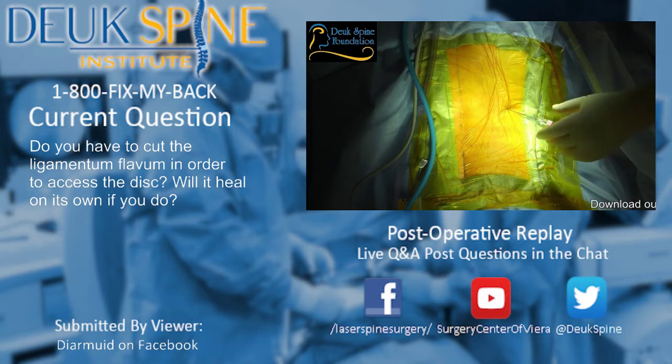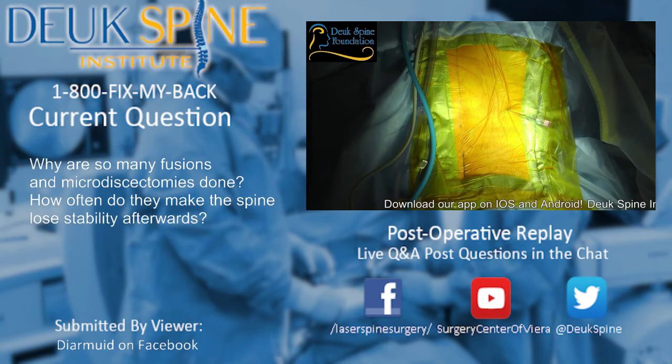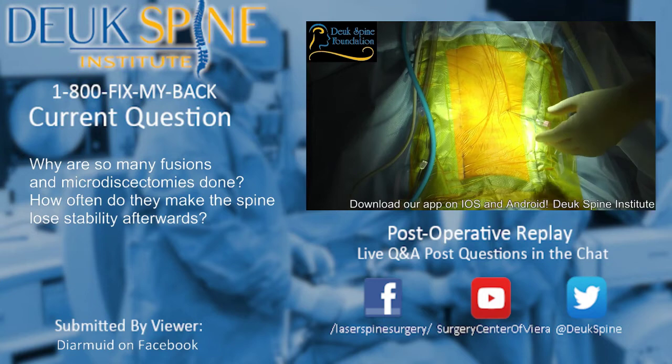And you don't have the destabilization that you get with more traditional spine surgery like microdiscectomy or laminectomy, where you're removing part of the joints, like the facet joint, where you're going to destabilize that segment and make it weak so that it ends up needing to be fused shortly after the surgery.